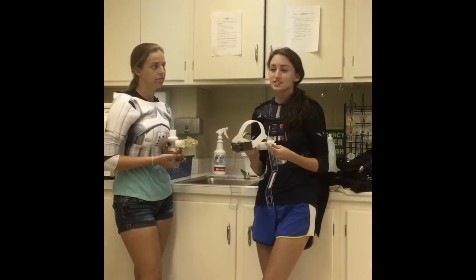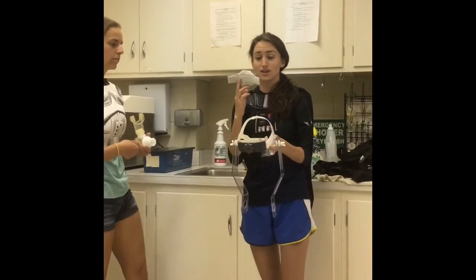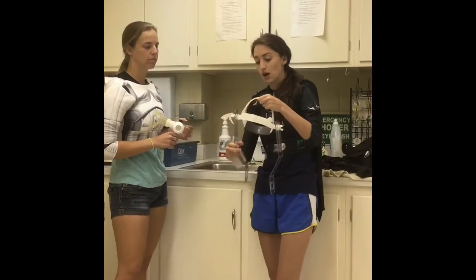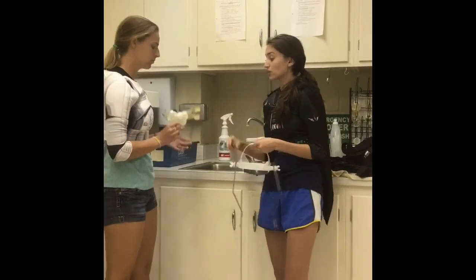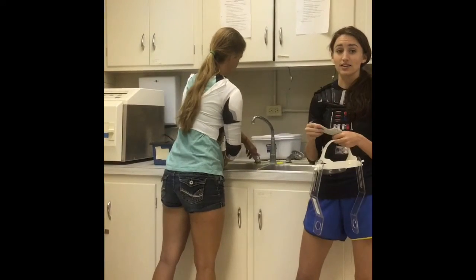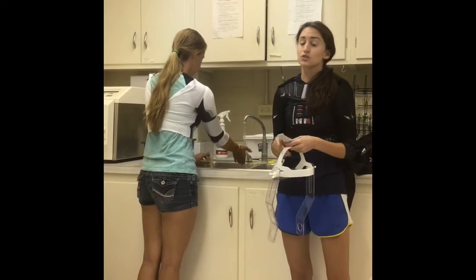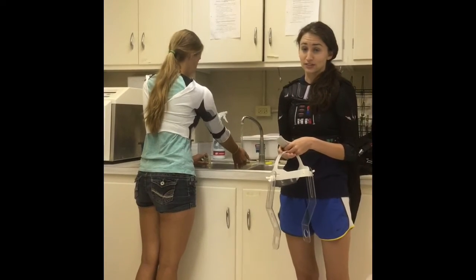Next, disassemble the headpiece and mouthpiece for cleaning. The headpiece has a little foam piece where the participant's forehead was — do not put this in the Cidex solution. The headpiece itself is just wiped down with soap and water. The actual mouthpiece pieces will be disassembled and placed in Cidex solution for 20 minutes for proper disinfectant precautions. Do not leave the silicone mouthpiece in the Cidex solution for the full 20 minutes, as it will eat away at the silicone and damage it.